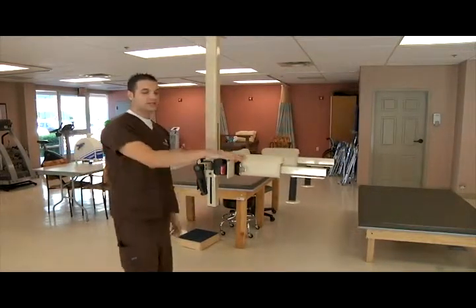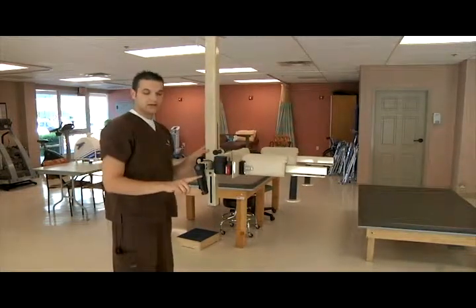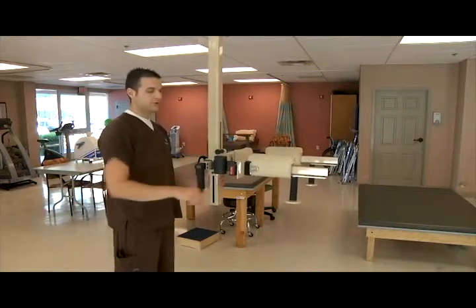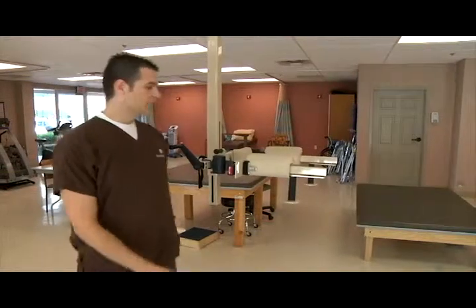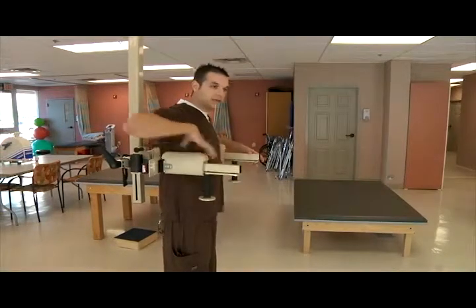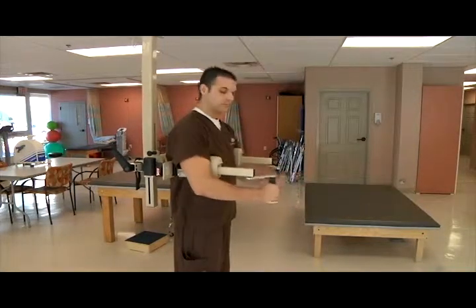So when the device is ready for the patient's height, now we have to prepare for the patient's width. What we're going to do for this is come to this lever here, we're going to pull it down, and then we're going to crank for this to be open. Again, to help accommodate the patient's width. Once the patient's in the device, and I'll act as patient, we're going to pull the device up to our back until the pad hits our back. We're going to open up the hand grips, all right? And we're going to make sure these pads are underneath our armpits.